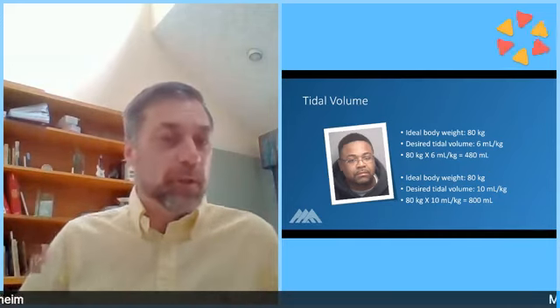Now, if that same guy weighs 80 kilograms, but let's say his CO2 is really high and I want him to blow off more CO2, well, I might turn that tidal volume up to 10 mLs per kilo. So 80 times 10 is 800 mLs. So I would turn my tidal volume up to 800 mLs, and that would help him blow off more CO2 temporarily. So that's how we can use tidal volumes to adjust the CO2.